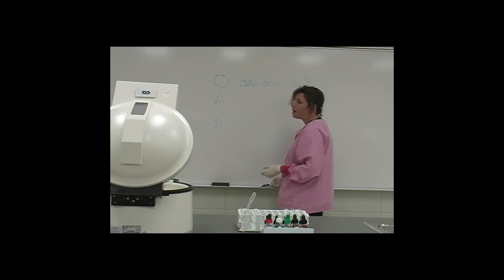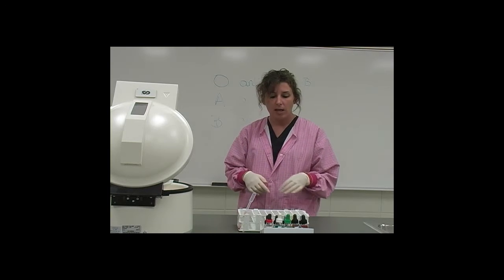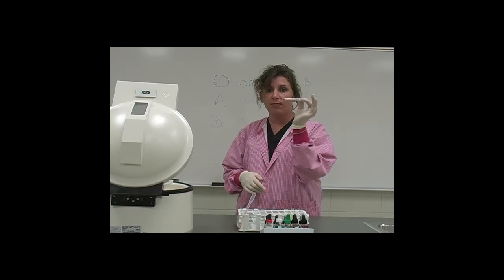Same thing for Rh types. If you're an A positive person or an A negative person, you would see that positive or negative depicted in this D tube.